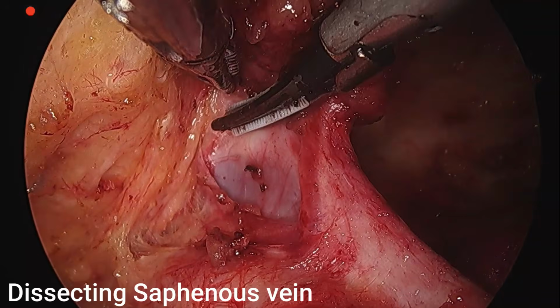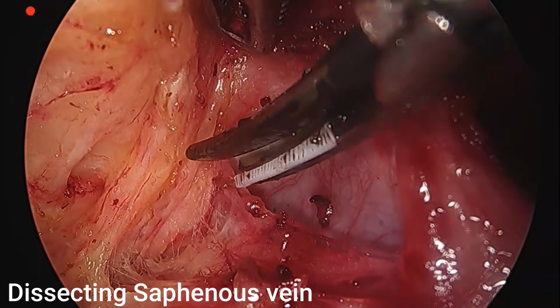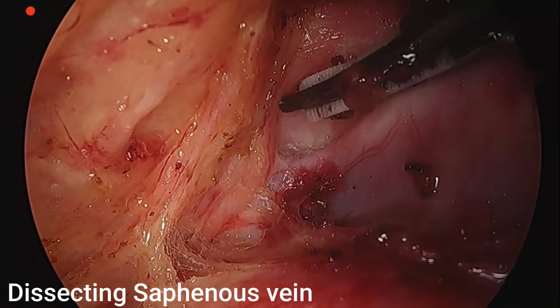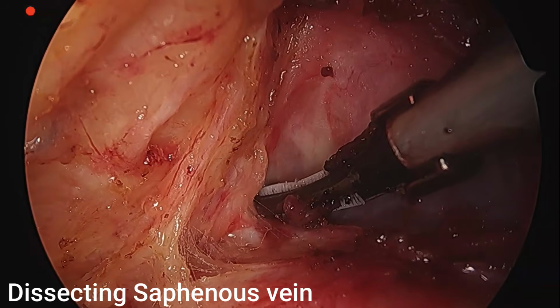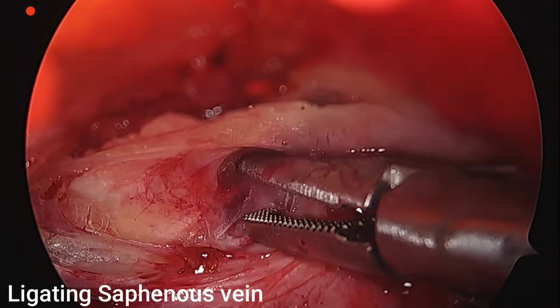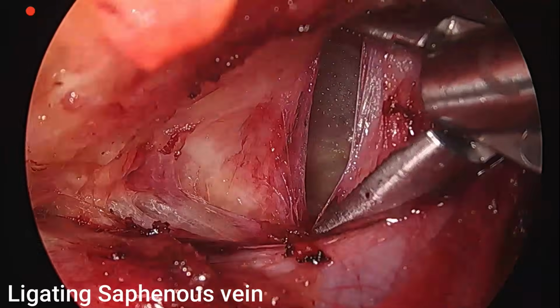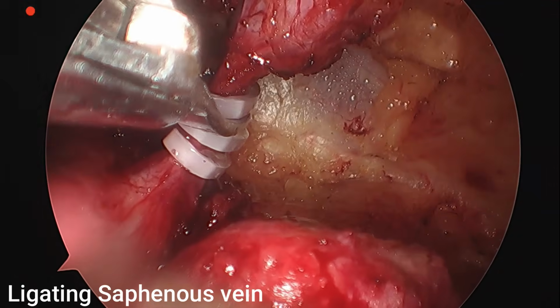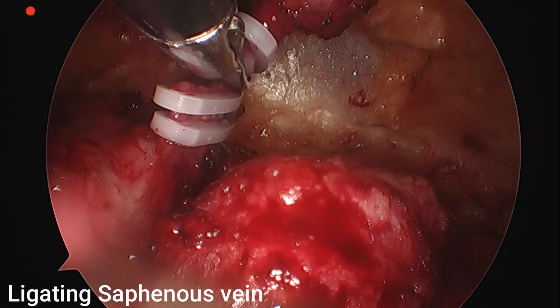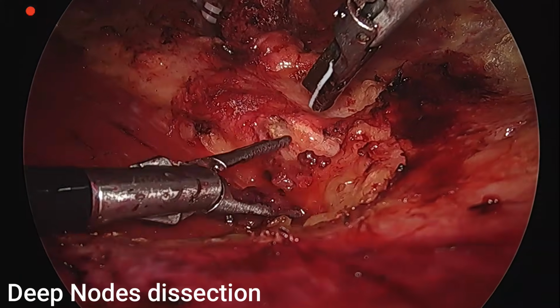vein. Now you can see the femoral vein is exposed and the upper border of the femoral vein is dissected so that the communication between the saphenous vein and the saphenofemoral junction is completely exposed, so that we are able to ligate the saphenous vein and clip it so that the superficial nodes and the deep nodes are completely separated. Once the saphenous vein is isolated like this, a Hem-o-lok clip is placed across the saphenous vein and the saphenous vein is cut. After this cut, the superficial system and the deep systems are completely separated.